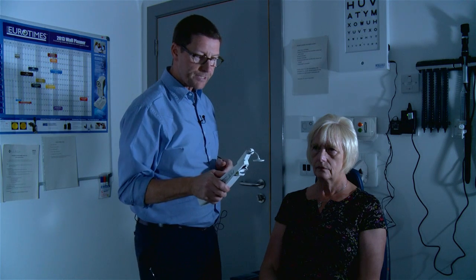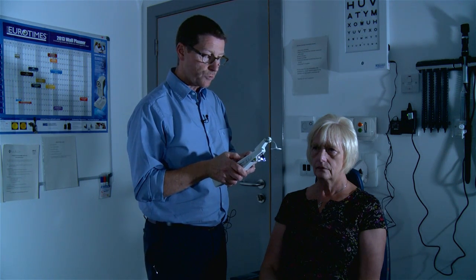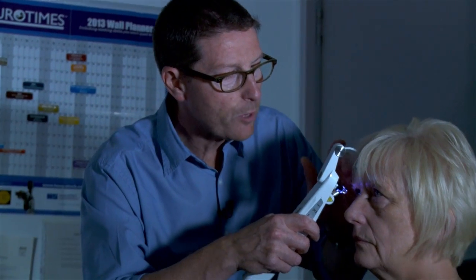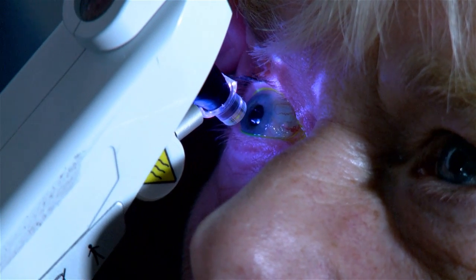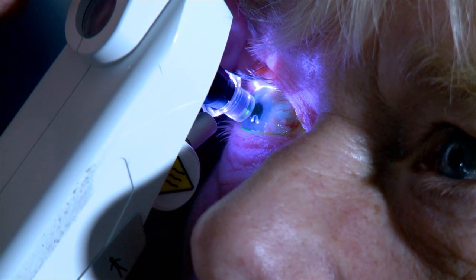You set the instrument up to read at 18, like I did the last time on the Goldman — that's my one-touch technique, that's my safety point. If you look up towards the corner of the room up there, using the brow bar, get the instrument into position just to drop in place, pull the top lid out of the way.